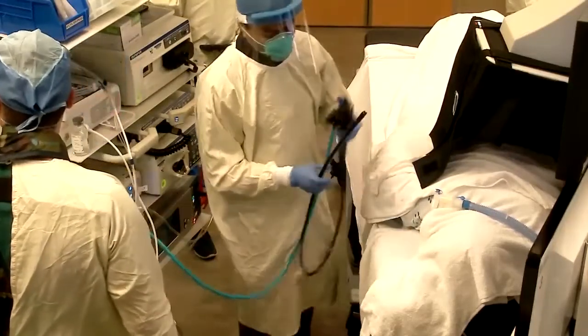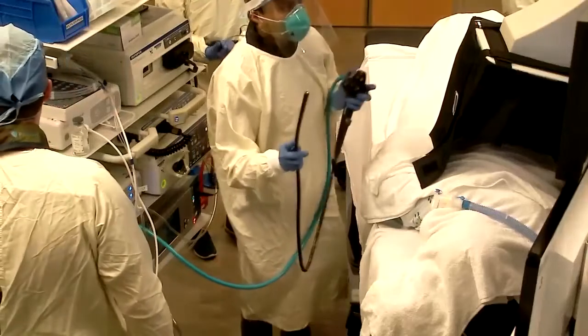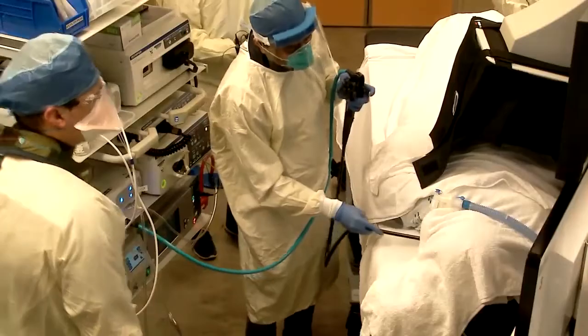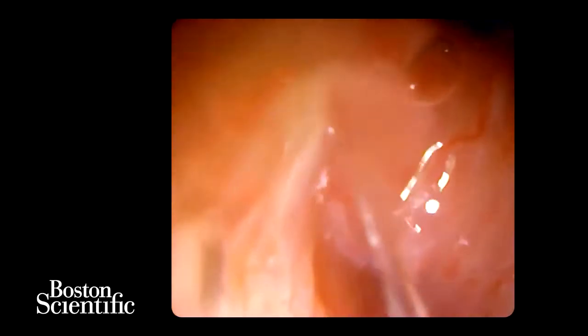And we're sharing. So now we are going to demonstrate the endoscopy view. So let's have endoscopy on my screen. So this is the process of intubation. This is the same as what you will do with a conventional duodenoscope. If you have any stiffness, you can always, this patient is a little elderly, and the duodenoscope is now passed through the oropharynx.